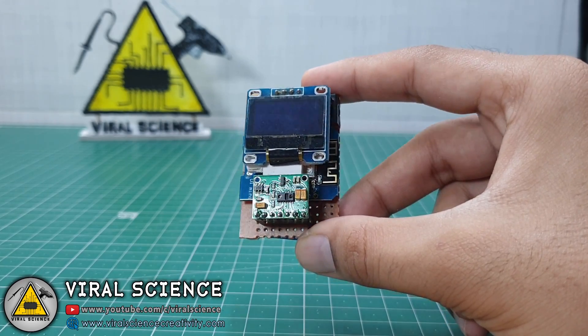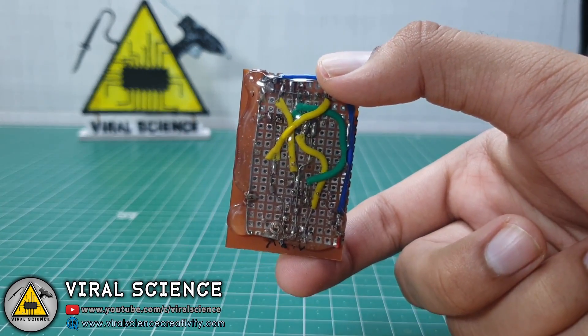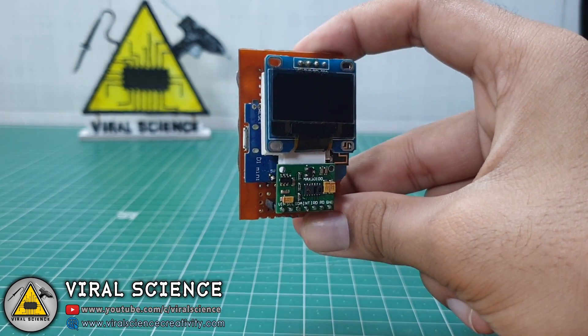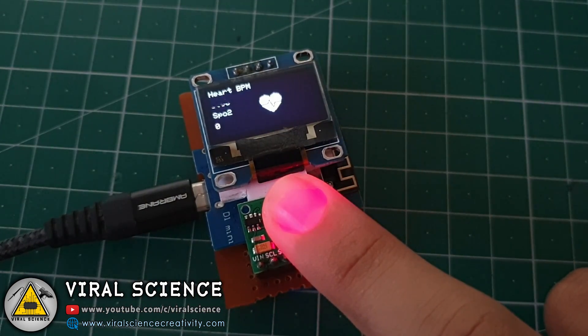To make this thing portable, I have assembled everything on a PCB and soldered it, and applied some hot glue to seal the connections. Now this is ready — it's very compact and you can carry it anywhere. It is powered with a USB cable and it works the same.